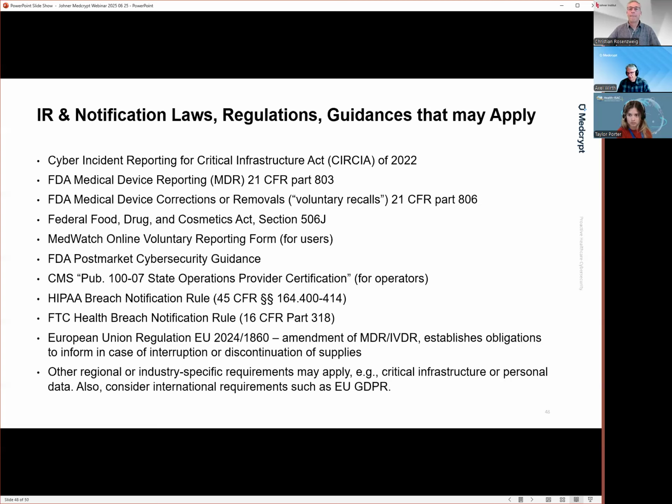There's also a difference in who would participate, right? I think pre-market, a lot of the vulnerability decisions will be made by engineers, and only a small subset will be escalated to safety experts, clinical experts, and so forth. Whereas in the post-market, because it is something that is present in devices that are out in the field, I think by definition you need your clinical and safety experts involved right from the beginning.